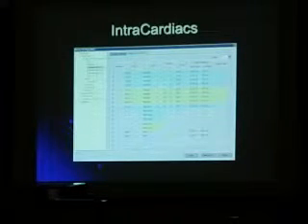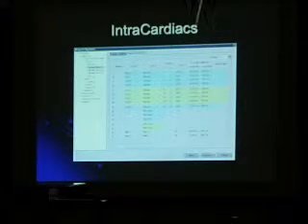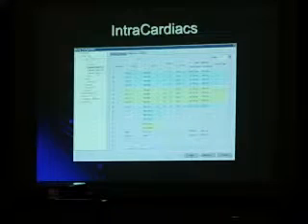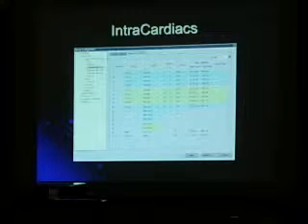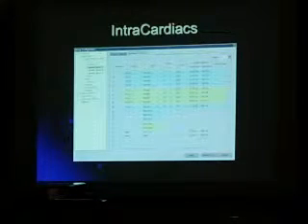So our settings for this, by default, is 30 for high pass, and that's because it's a bipole antenna that's very short. Basically anything 30 or less is going to get washed out because of our small little antenna. That antenna really starts kicking in at about 20, 25 hertz. It's filtering out a lot underneath that. So that's why we set it as a default at 30.